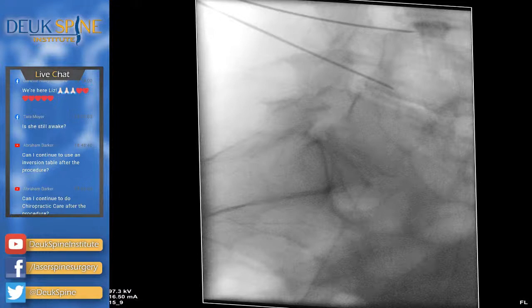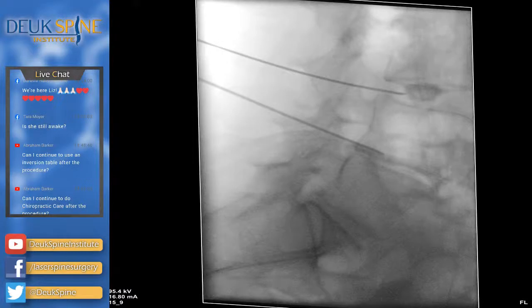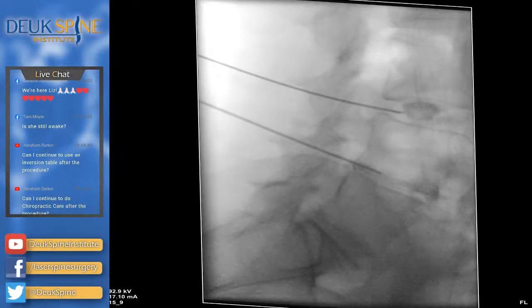Release the wag. Shot. Does that look better to you guys? Shot. It looks worse to you?